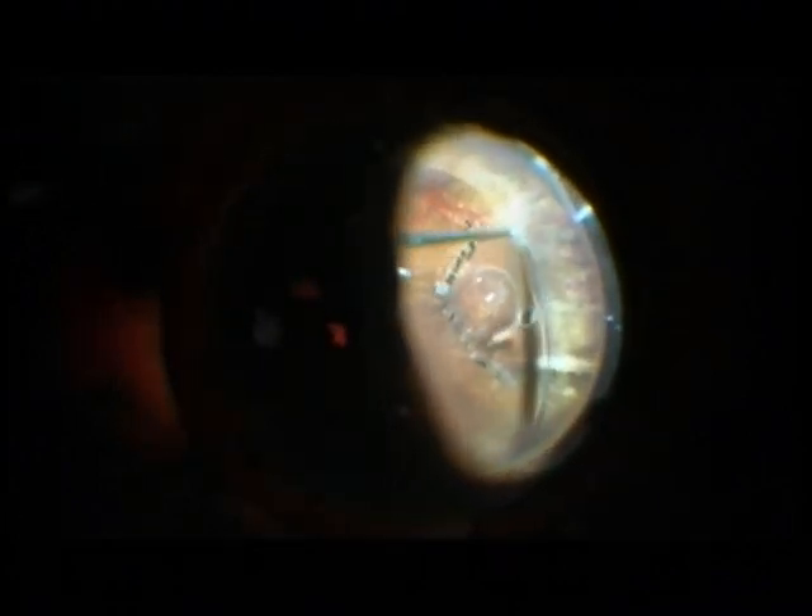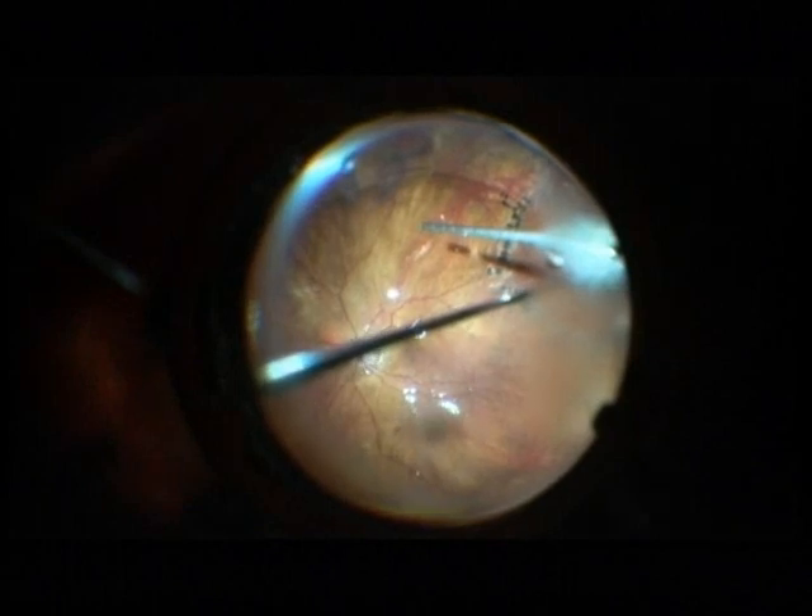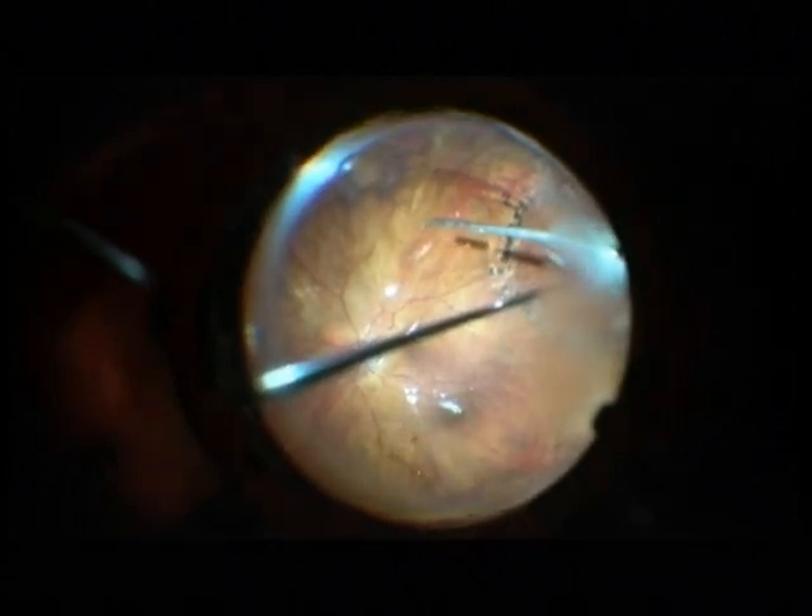I am continuing now with trimming of the vitreous base. I always use a chandelier light for detachment surgery in order to indent the sclera. I prefer to use a Synergetics 25 gauge light, which gives a very nice panoramic view of the retina.